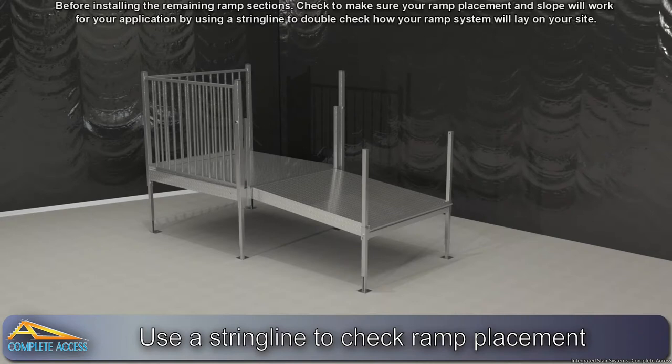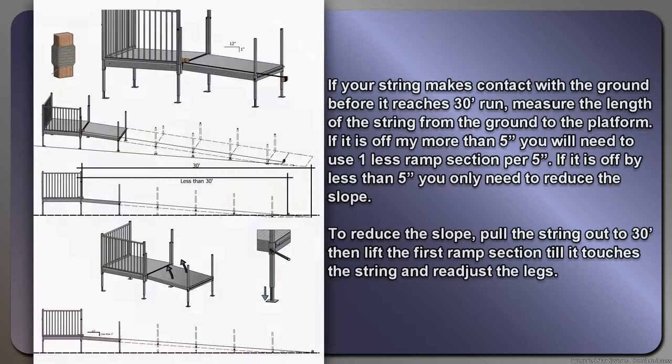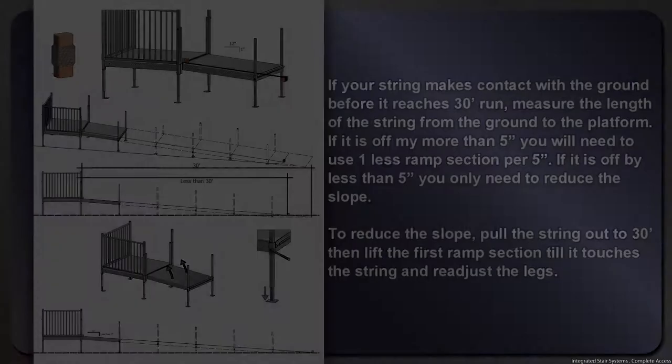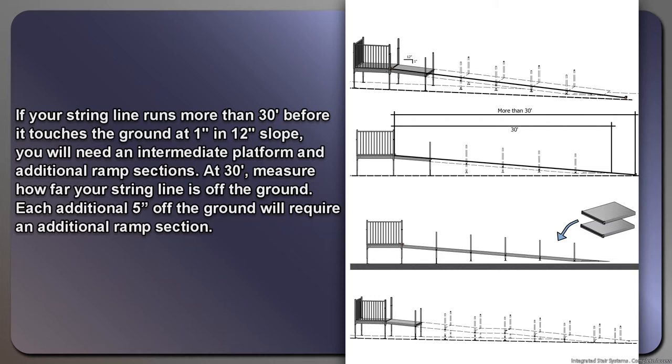Before installing the remaining ramp sections, use a string line to double check how your ramp system will lay on your site. If your string makes contact with the ground before it reaches 30 feet of run, measure the length of the string from the ground to the platform. If it is off by more than five inches, you will need to use one less ramp section per five inches. If it is off by less than five inches, you will only need to reduce the slope. If your string line runs more than 30 feet before it touches the ground at a 1-in-12 slope, you will need an intermediate platform and additional ramp sections. Each additional five inches off the ground will require an additional ramp section.